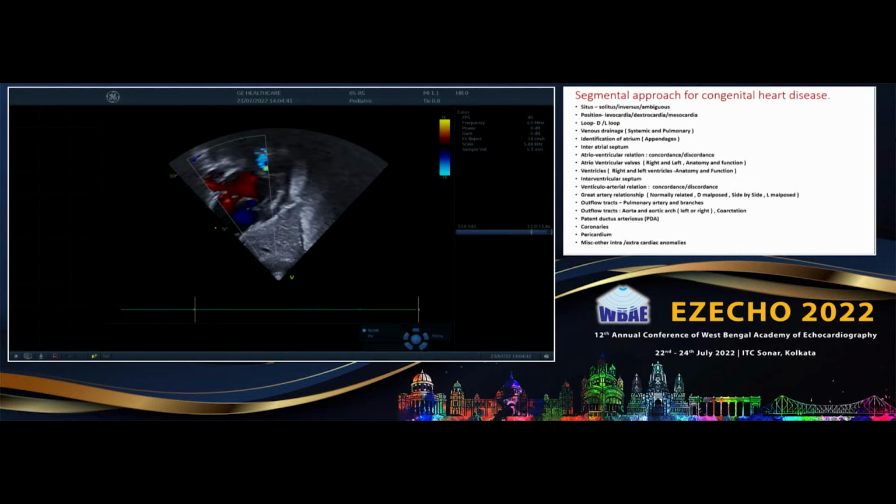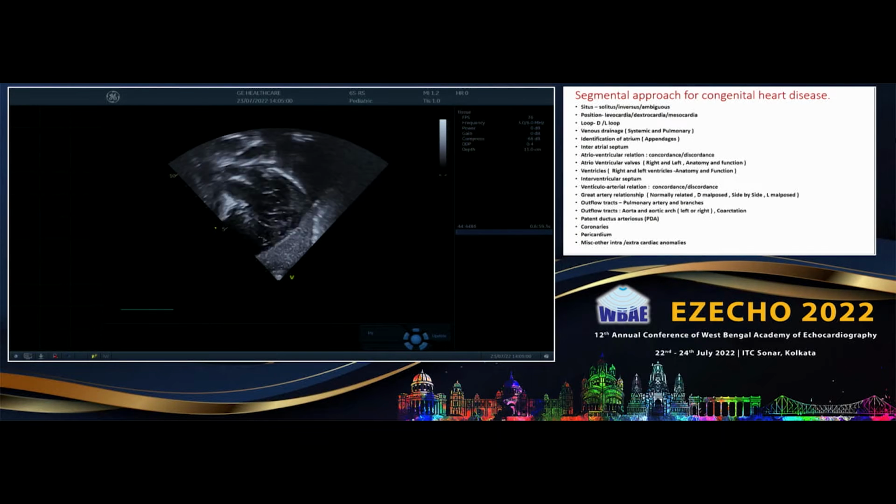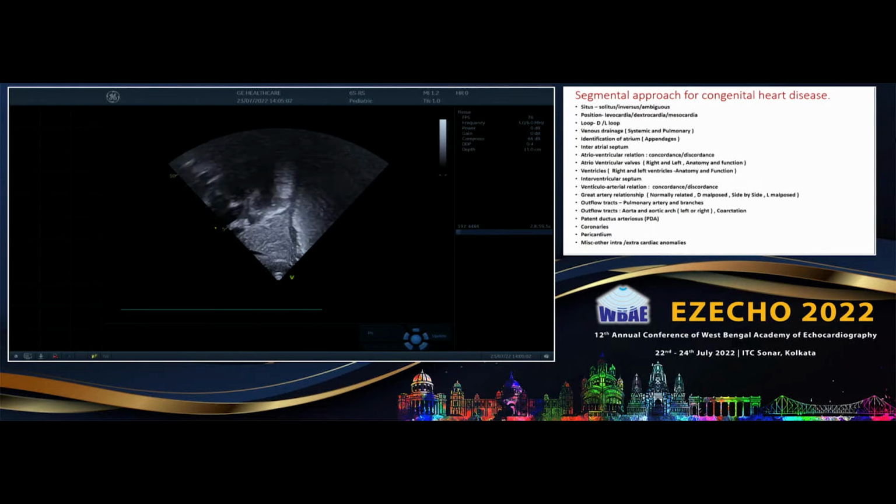From subcostal we can see the right upper; from the apical four-chamber view we can appreciate only the right lower in that plane. The three veins we see in the four-chamber view are the right lower, and the left upper and lower. This is shown from the modified subcostal view.